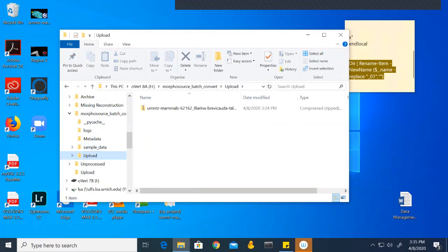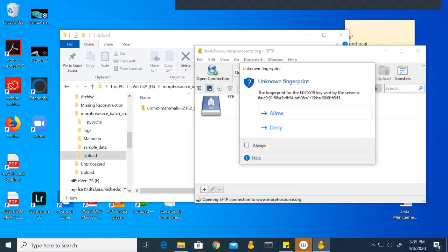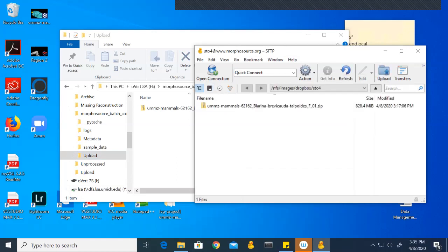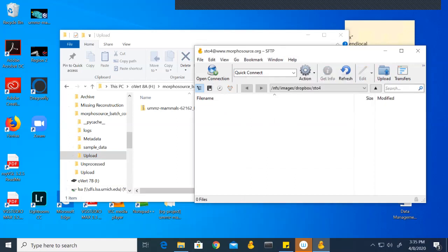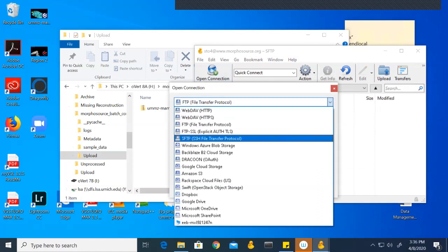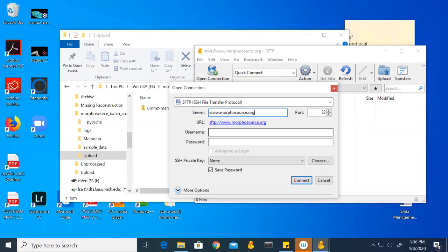Next we have to put this onto Cyberduck. What Cyberduck does is it's a portal that allows you to upload specimens onto it and that will automatically put onto MorphoSource for you. We need to open a connection and change this to SFTP. The server is www.morphosource.org. Here's where that DukeNet ID comes in. When you ask MorphoSource for those batch uploading permissions, they'll give you a username and you'll set up a password. This is where you would enter that information and you click Connect.